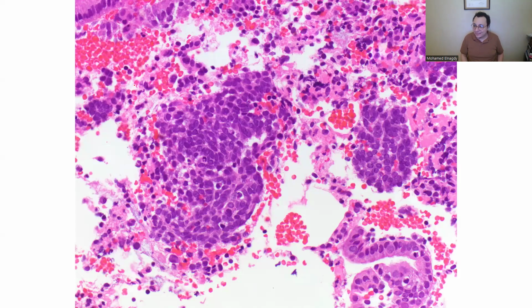Okay. Siham, what do you think about this? This looks like the blue cannonballs. The blue balls, the blue cannonballs, and see, these are blue balls floating in blood. See the blood in the background? So blue balls floating in blood. So this is glandular and stromal breakdown, which happens in dysfunctional uterine bleeding or dysfunctional endometrium, right?